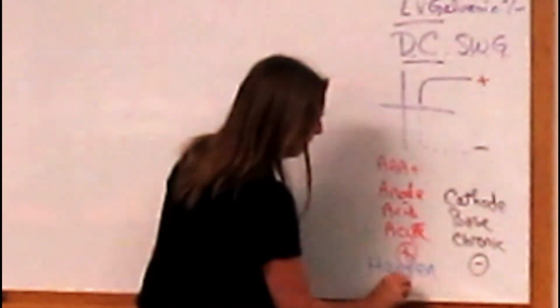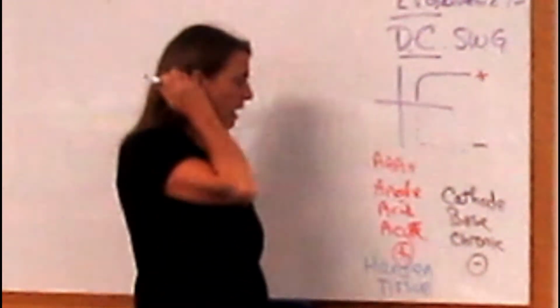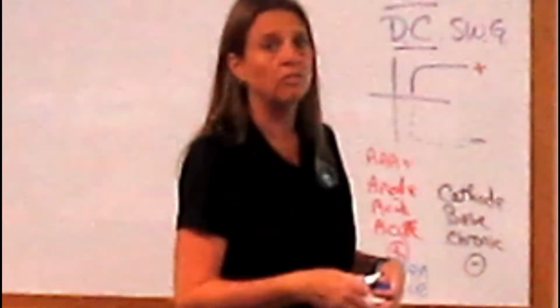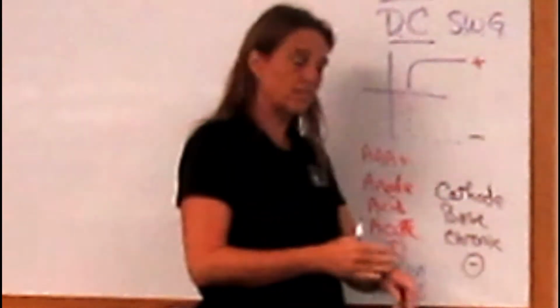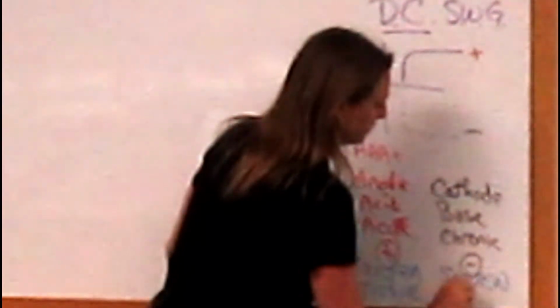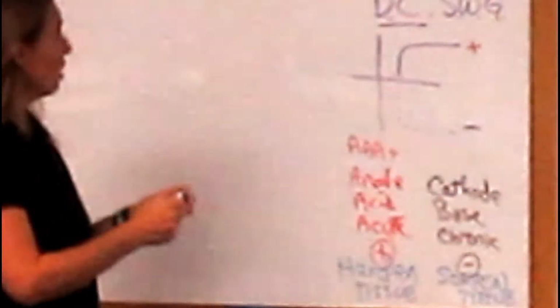And of course, if you're looking at the cathode, it's a base, it's treating chronic stuff, just like taking a nice hot tub, a hot bath, putting on a hot pack, using some of the diathermies in order to soften the tissue. The cathode, the base, is going to put out an effect that's going to soften the tissue. Okay? Now, that's all E-Chem.